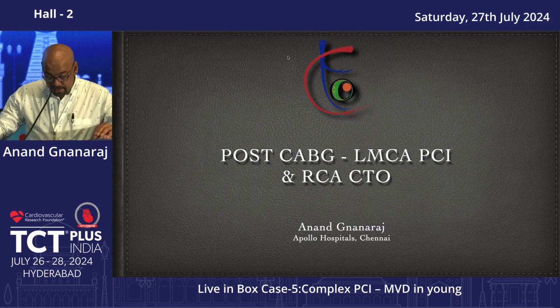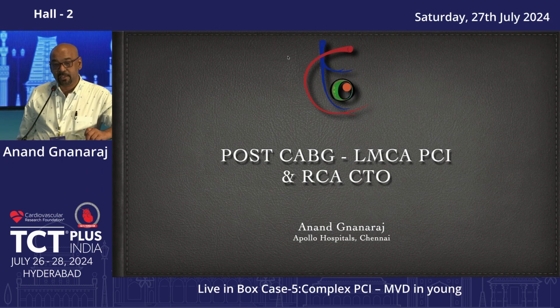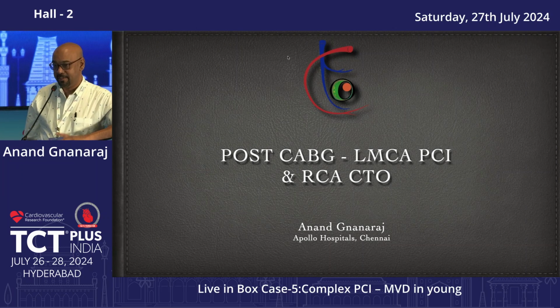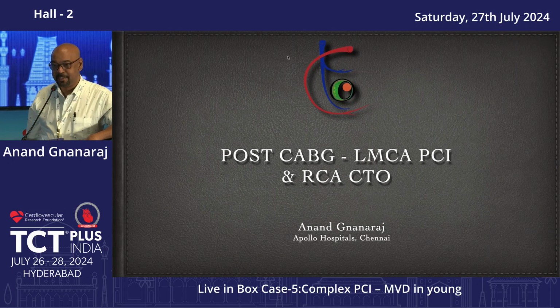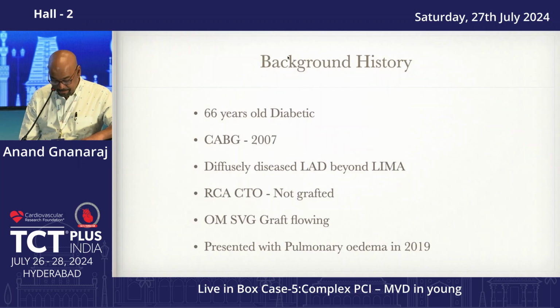This is a live in box session. This is a post CABG patient. Actually, this was not intended to be recorded for live. We had an actual live case that evening, so the camera was already set up in the cath lab. So I asked them to just record it to see how the case goes. But then it turned out a little more dramatic than we expected.